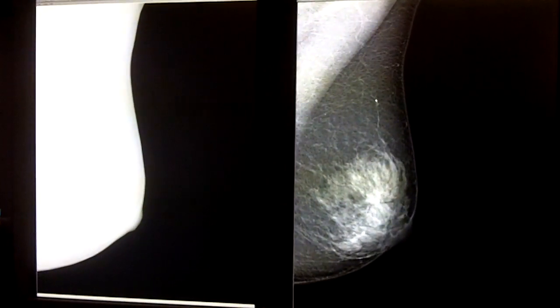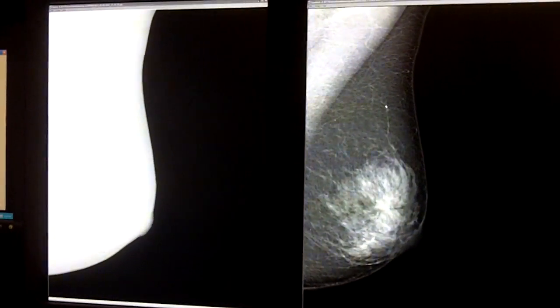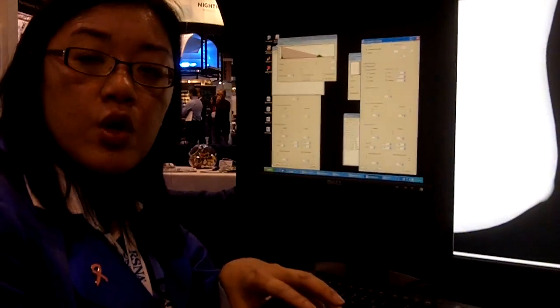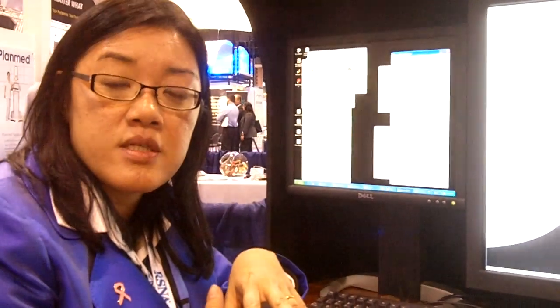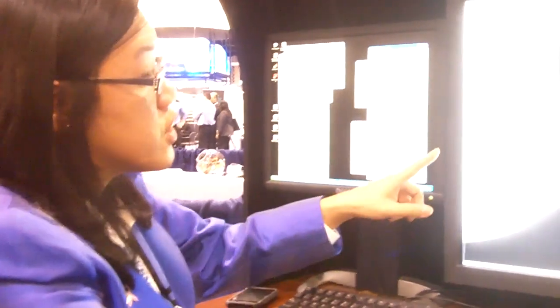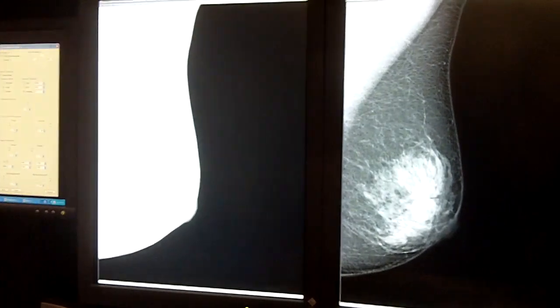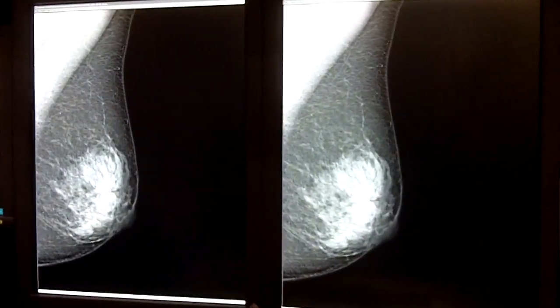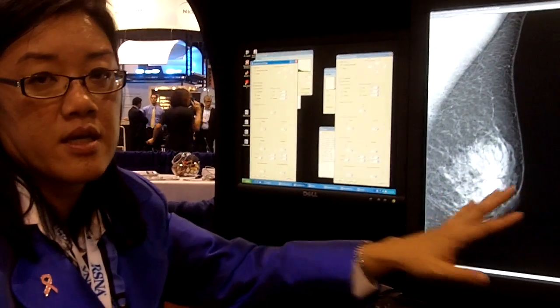This is an image that we process and it takes approximately 10 seconds to process. By putting our Adara algorithms onto the GPU, we are able to substantially increase the speed of image processing. This is the GPU version, and as I press this to do the processing, it's actually 10 times faster — the difference is 1.5 seconds versus 10 seconds.